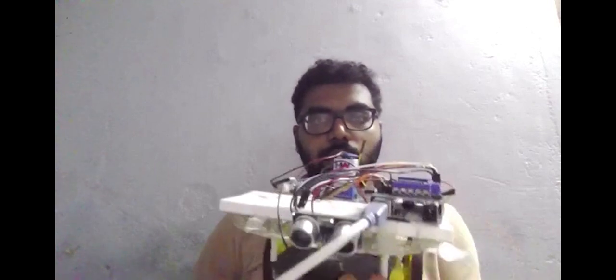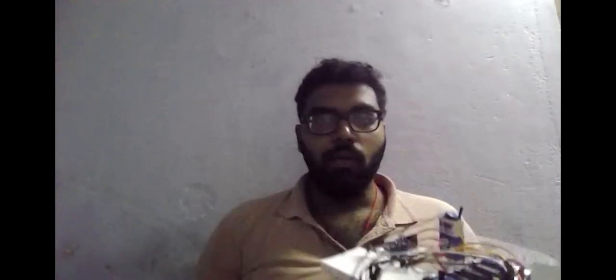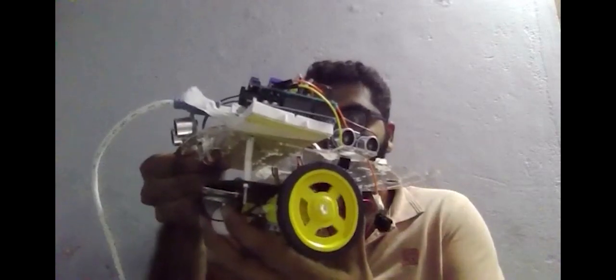As you can see here, I'm looking straight, so both wheels of the working model will be running. Now I will look to the left. What will happen is the left one will stop and only the right one will be working. Now I will look to the right. Now only the left one will be running. You can see here, this is our working model. Thank you.